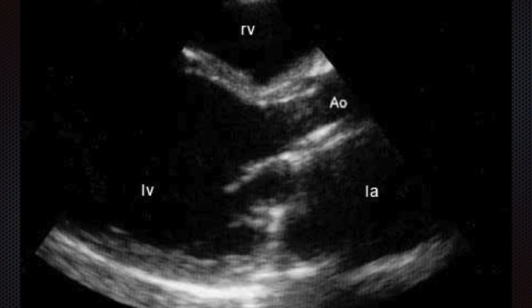In this next slide, we can see that the left atrium, even though we've got no reference points with markers, we can see in relation to the other aspects that the left atrium and the left ventricle look huge, and this is somebody who had dilated cardiomyopathy. So remember, the maximum diameter that we'd expect of the left atrium would be no more than 4 centimetres, and the maximum internal diameter at the end of diastole of the left ventricle should be really no more than 6 centimetres. So actually in this one, this is much more.